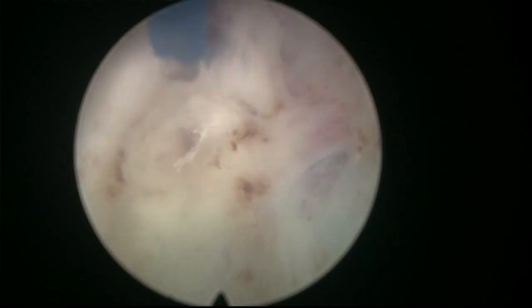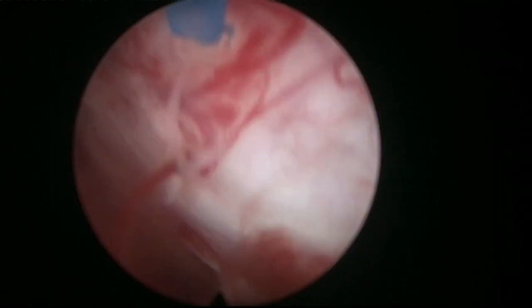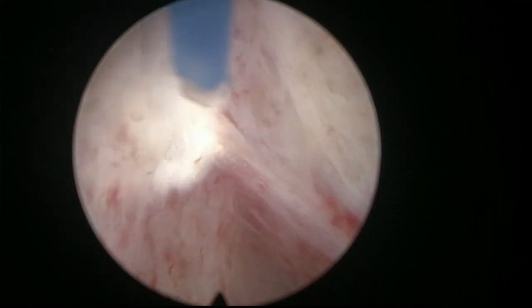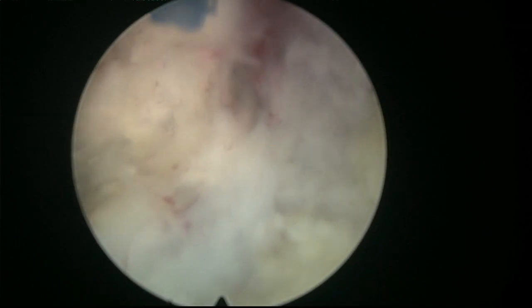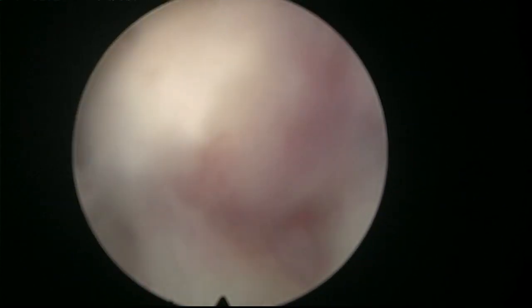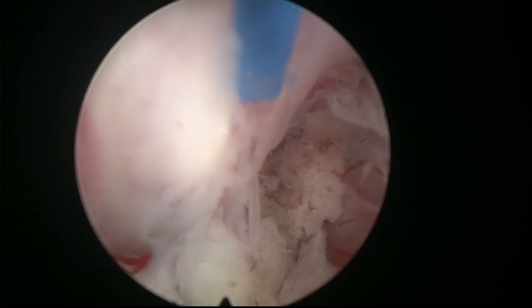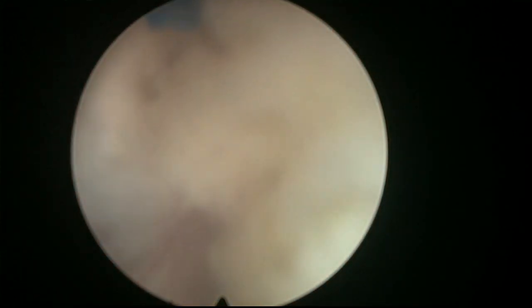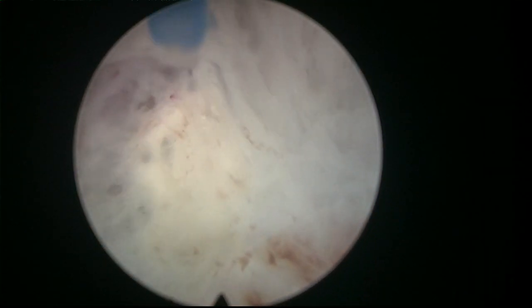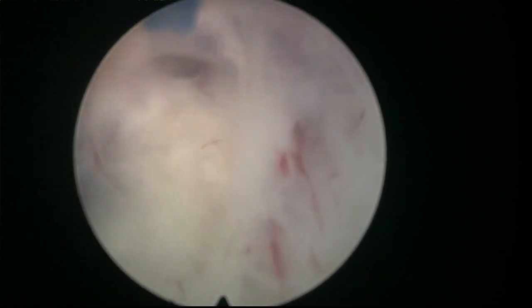Now here we are. You see why I find it useful to develop the posterior plane a little bit, because when you're doing this dissection of the lateral aspect, you get orientation in the lower part, in the posterior. But here we're coming up, up, up. Let's see what we have here. You see, this seems to be okay, 12 o'clock. Although the visibility here is falling very fast. So let's try to develop this lateral plane a little bit further.